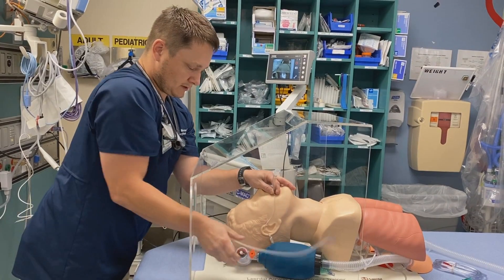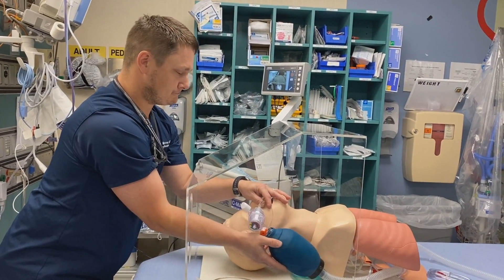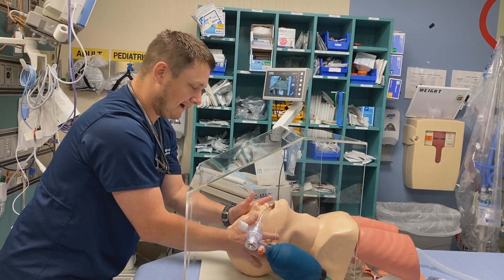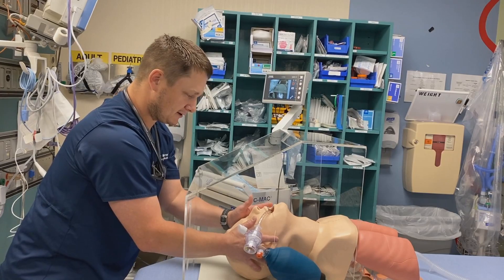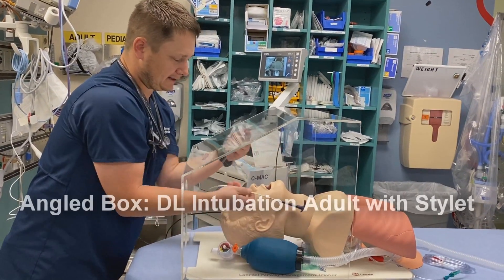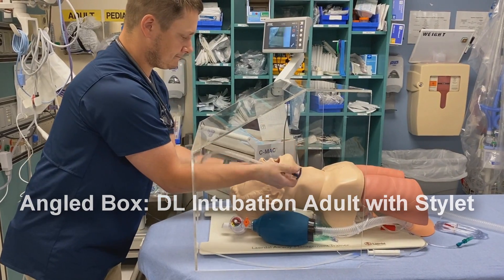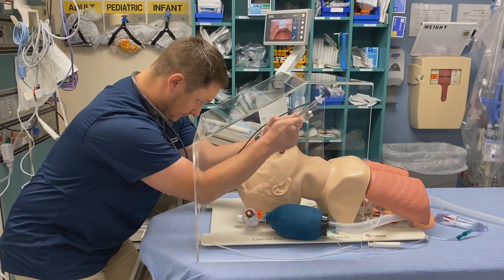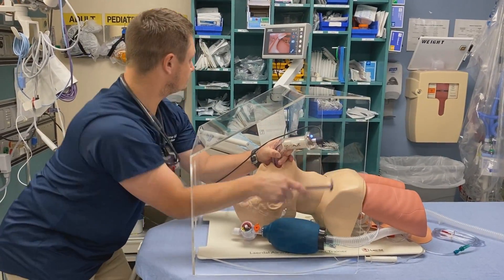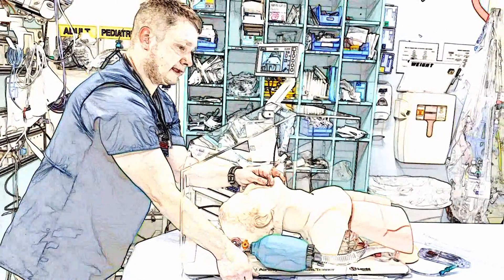Did the angled box or window box make a difference? I felt I could visualize much better without having to transition my viewpoint as much. Particularly doing DL, you want to identify your landmarks and be confident — I found I was moving and maneuvering myself less in space with the angled box. For direct laryngoscopy, I like the angled box personally.